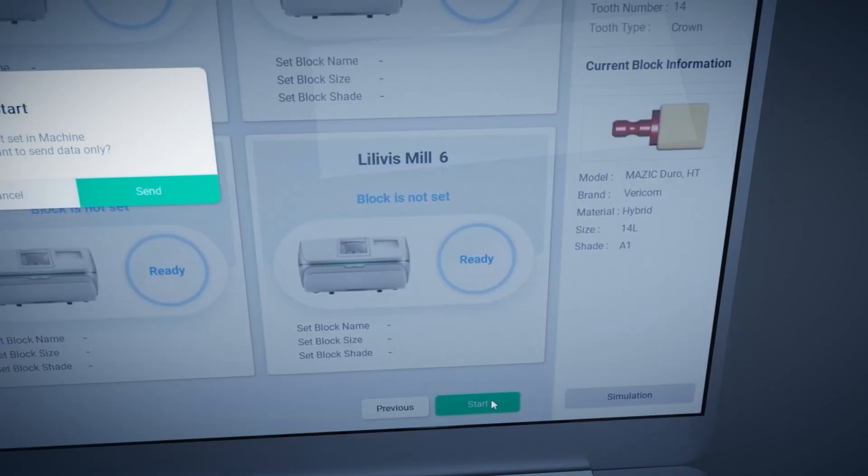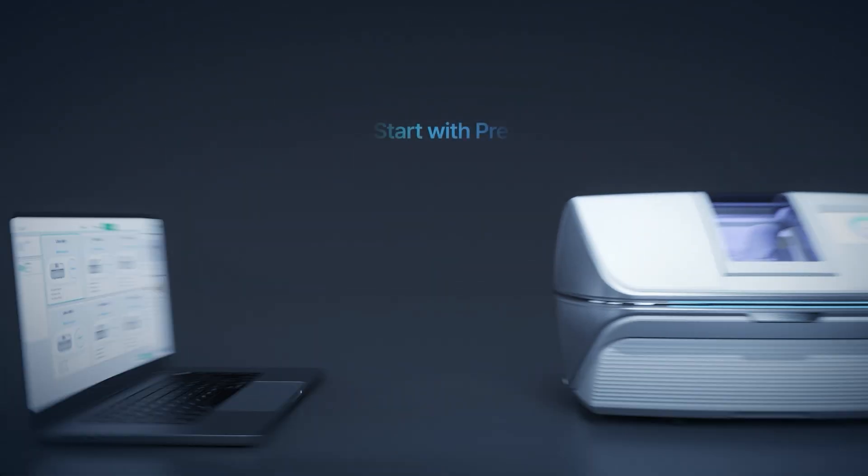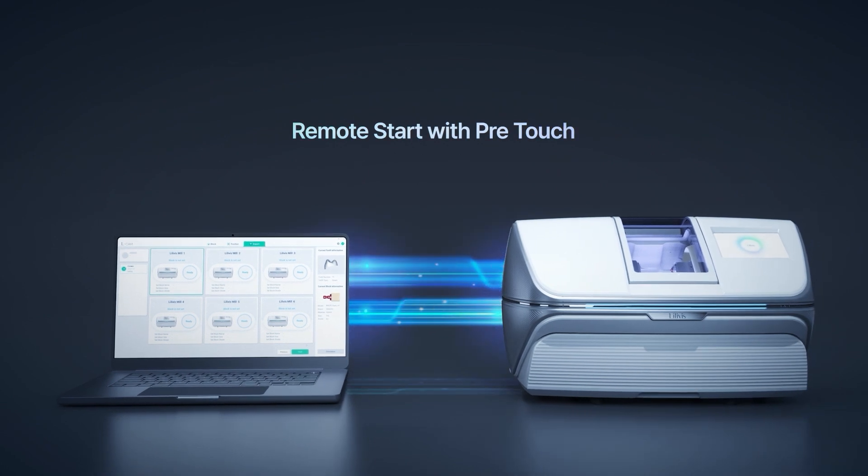Experience a more straightforward and efficient milling process with the pre-touch feature that allows remote operation with just the material selection.